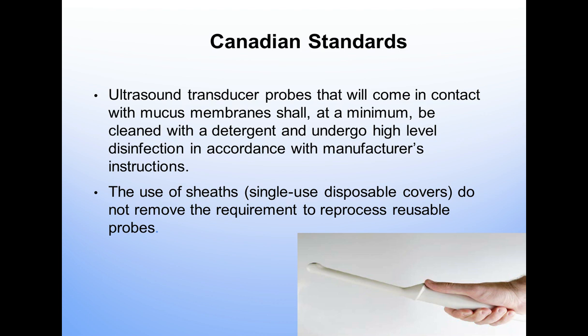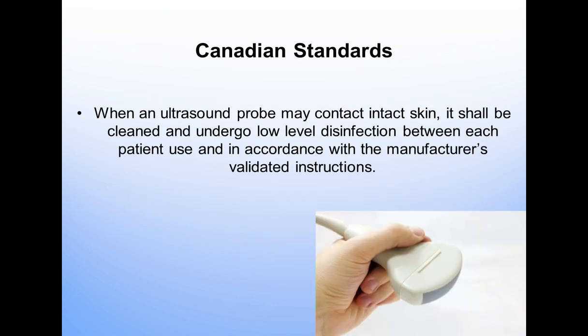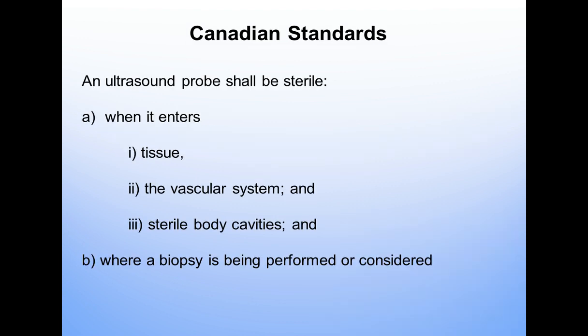The use of sheaths or probe covers, they must be single use. They do not remove the requirement to reprocess reusable probes, and I did state that a few slides back. When an ultrasound probe may contact intact skin, it shall be cleaned and undergo low-level disinfection between each patient use, and of course, again, in accordance with the manufacturer's validated instructions.